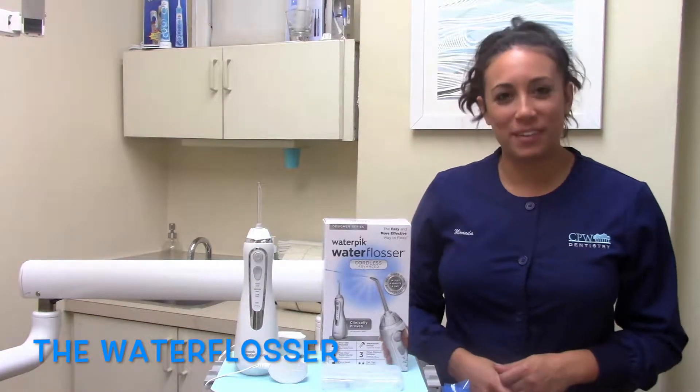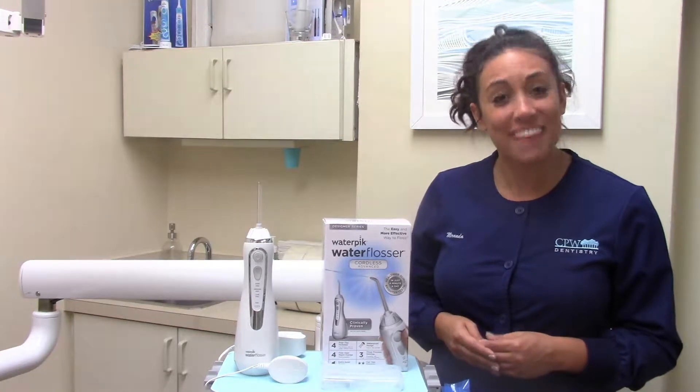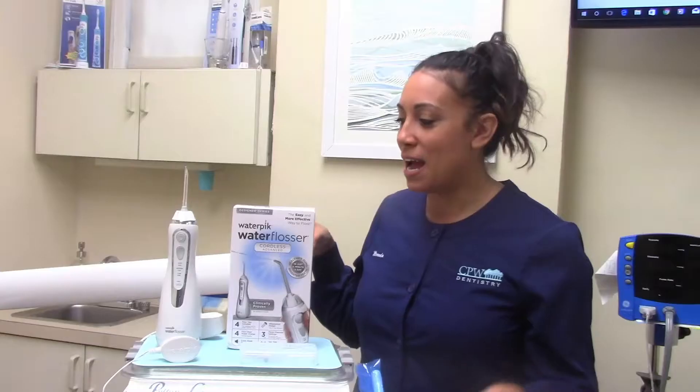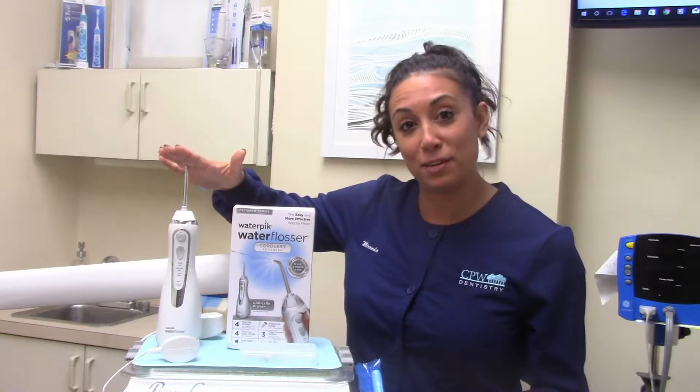Hi everybody, my name is Miranda and I'm one of the hygienists that works here at CPW. I want to thank you for coming on over and checking out our video on the water flosser. I'm going to show you today how to use this device and make your life a little bit easier.